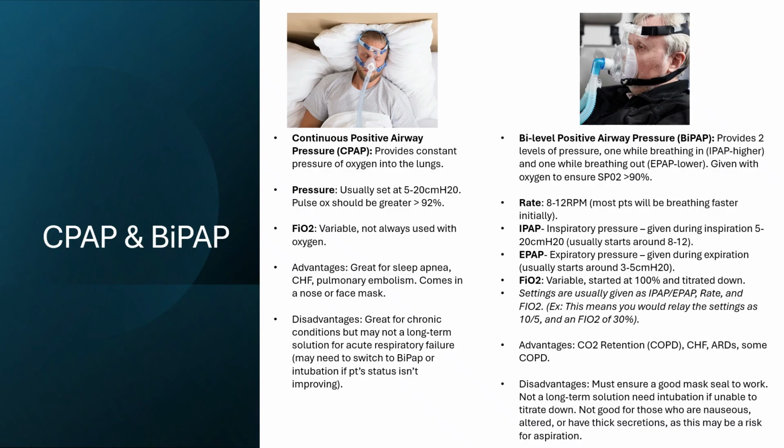Now your FiO2 is going to be variable, and I say it's variable because not everybody hooks theirs up to oxygen. So like if you have a sleep apnea patient, they're not going to hook theirs up to oxygen necessarily. So the FiO2 could just be that 21% room air. It certainly could be variable. There are other patients that do hook up to oxygen. So it kind of depends. Now this is great for sleep apnea, sometimes CHF patients, pulmonary embolism.